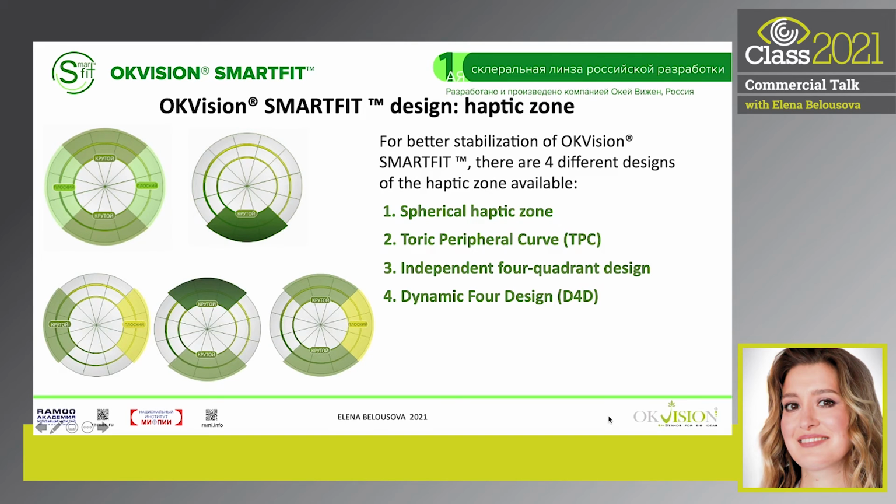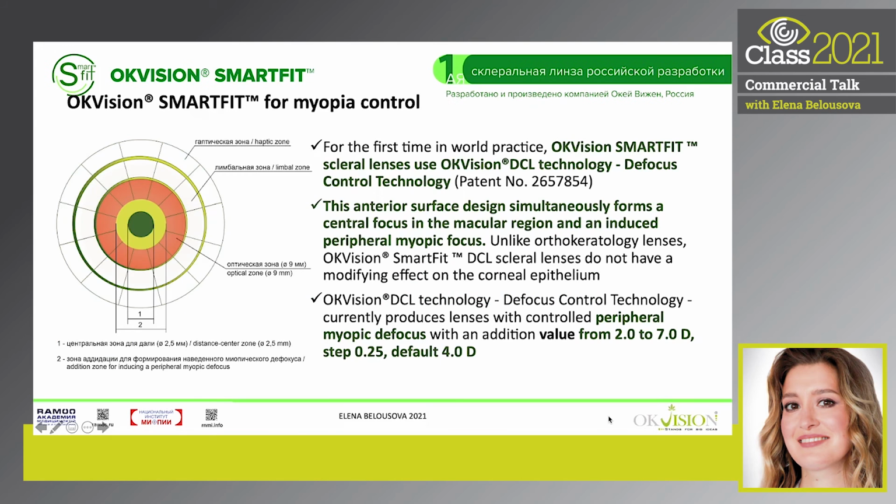And finally, to summarize, we have 4 haptic zone designs, and we can choose one of them for better alignment of the haptic zone when we work with OKVision SMARTFIT lenses.